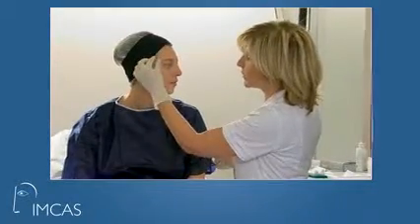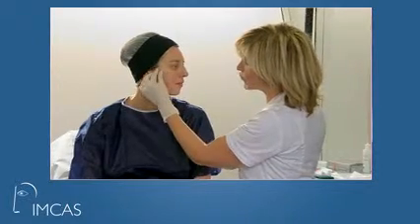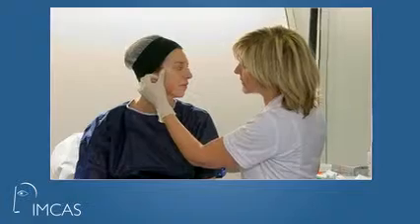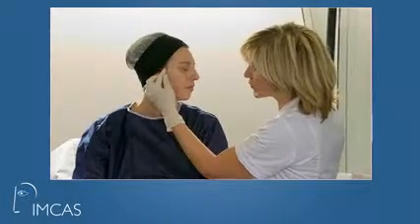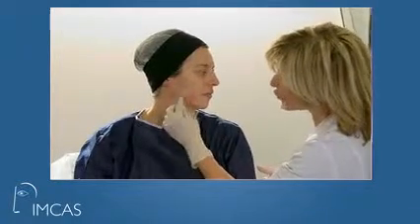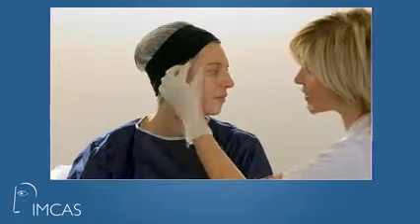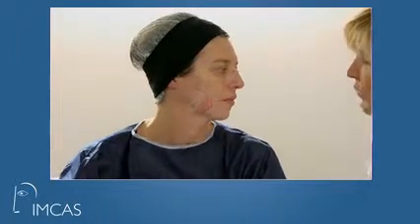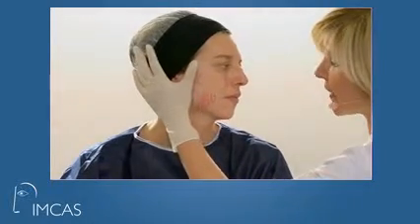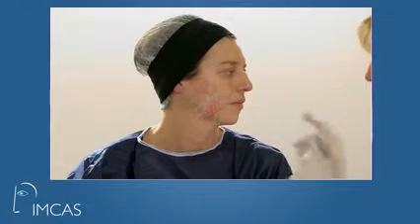So we have to consider the lateral area, as I did the drawing before, and to enhance the zygomatic area, this square that I drew before, and the triangle in the retromandibular area. This is very important to consider, and when we inject and we restore the loss of volume in this part of the face, we will create a facelift effect. Of course, we are only with fillers.